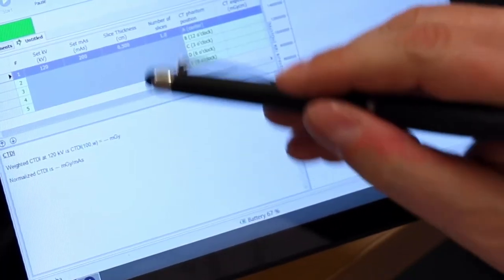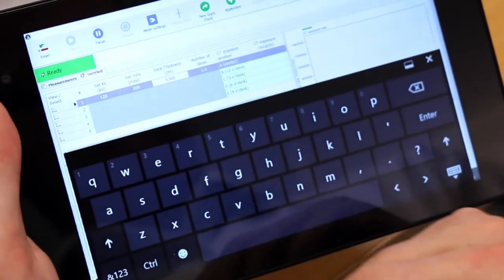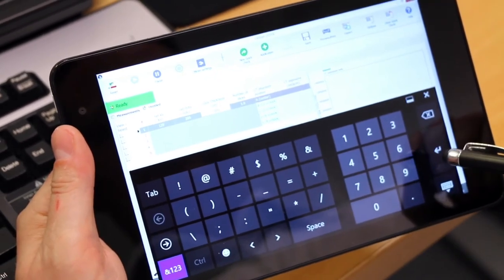If not, tap on the set value you wish to replace, tap the keyboard icon in the lower right corner of the screen, type in the new value, press enter and then close the keyboard.